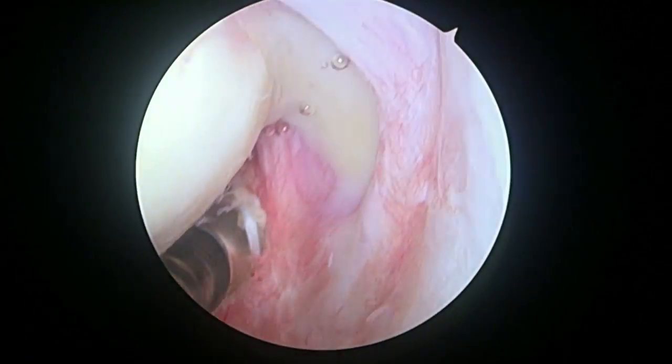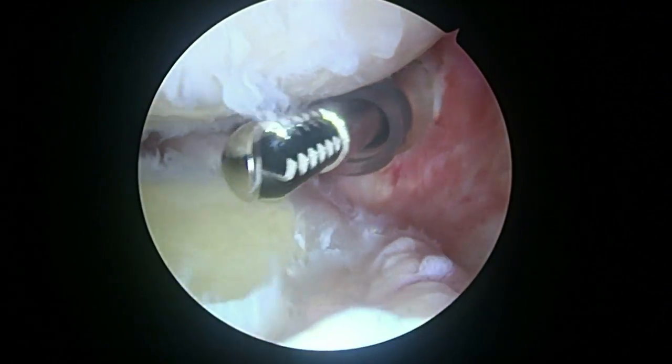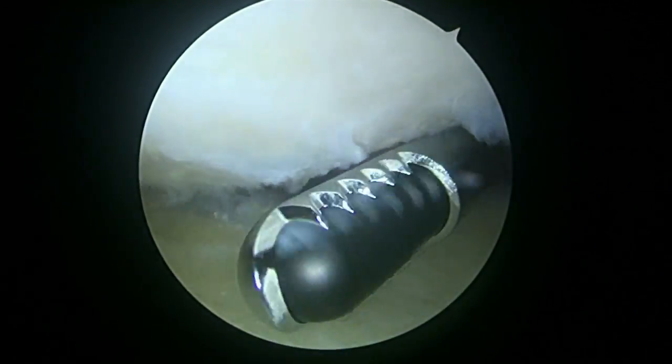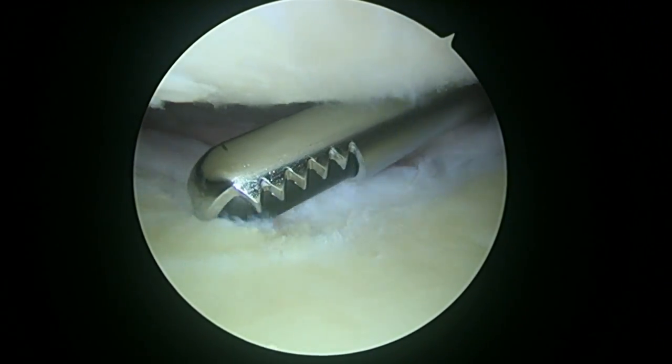There's the rotator cuff — that looks good, so that's encouraging. The biceps tendon is long gone; it used to be attached up in this region here, and it's gone. You've got some arthritic change, but the main reason we're here is to release the joint capsule, especially posteriorly.